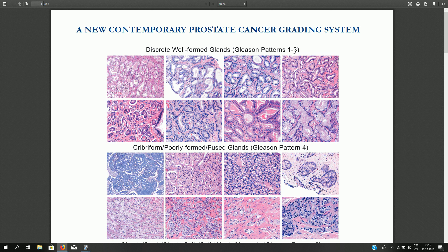The poorly differentiated, high-grade carcinoma is Gleason score 5+5=10. This is counterintuitive, because if you tell patients they have Gleason 6 adenocarcinoma out of 10, they would expect moderately differentiated disease with a poor prognosis — but that is not the case. Well-differentiated Gleason 3+3 adenocarcinomas are very slow-growing and not aggressive tumors. Therefore a new grading system — grade groups — was introduced, in which well-differentiated Gleason 3+3 is grade group 1, and everybody is happy.